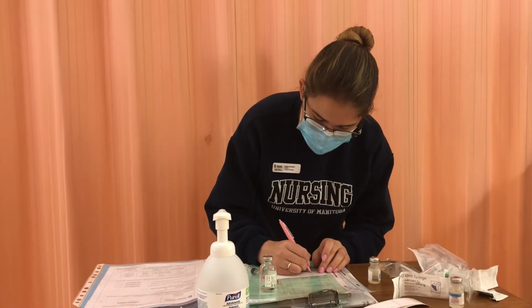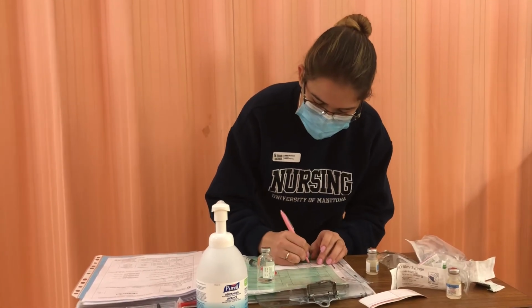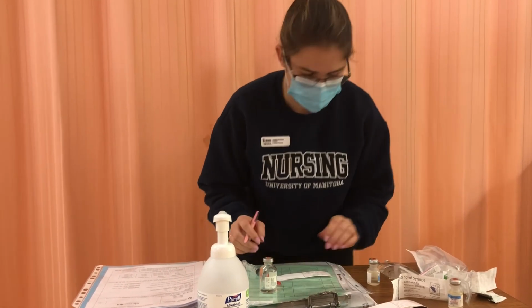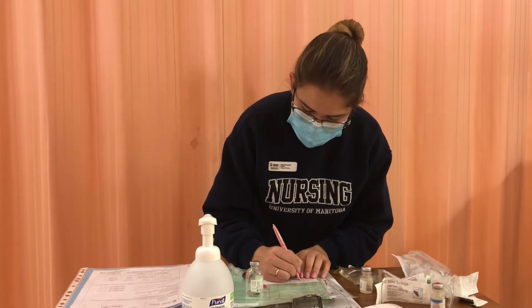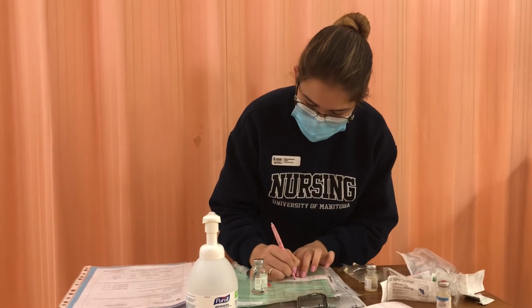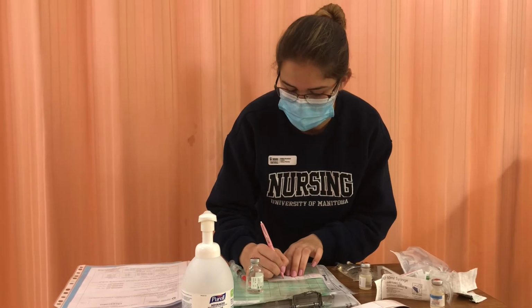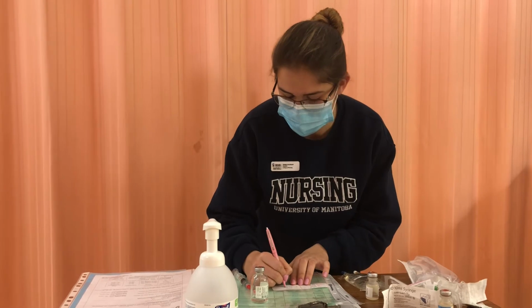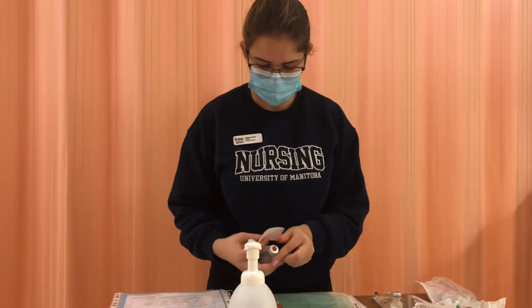3 mLs. The date and time is currently October 22nd, 1200 hours, and I'm putting my signature KKUMSN3. Okay, so the rate, once I combine it with my mini bag, it'll be 53. So my total volume will be 53 mLs. So my rate, since I'm doing it over 60 minutes to watch for side effects, it's going to be 53 mLs per hour. So I'm going to be watching for diarrhea, nausea, and asking her to watch for a rash. Okay, so now that I made my med label, I'm going to do my second med check.